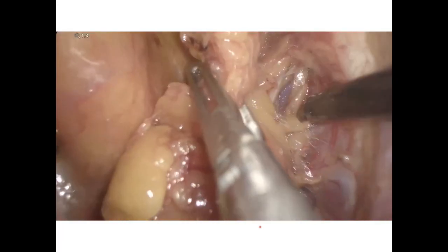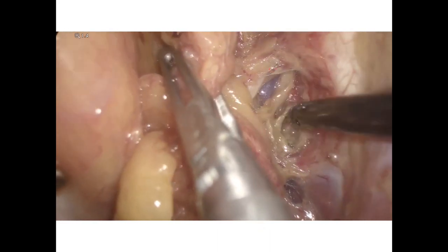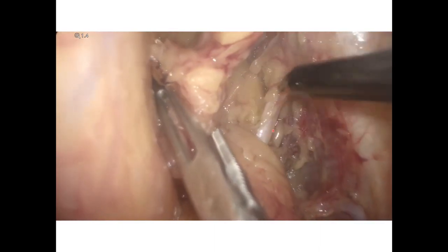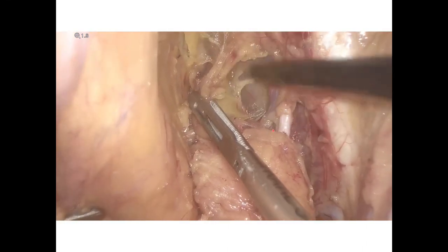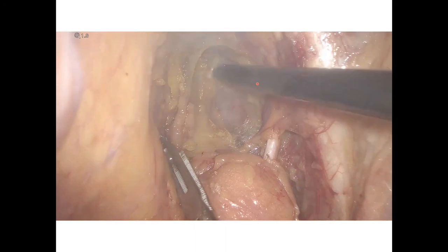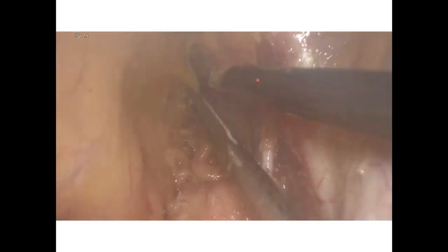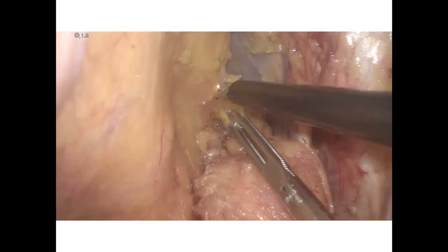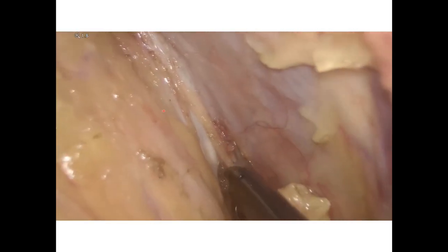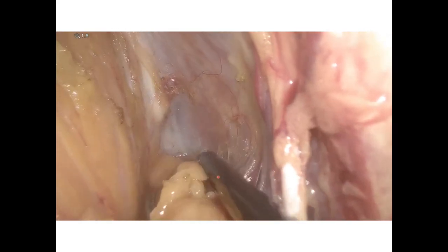This movement is occurring by the stimulation of the obturator nerve by the electrocautery. We can see the distal side of the obturator nerve. This is the internal obturator muscle. This is the bladder. Here we can see the tendinous arc of the levator ani muscle. This is the bottom of the lateral lymph node dissection.